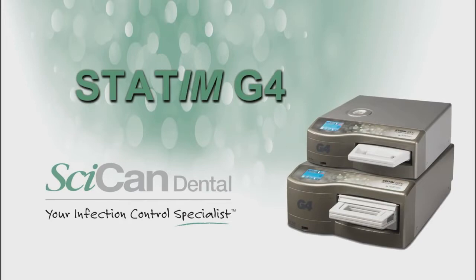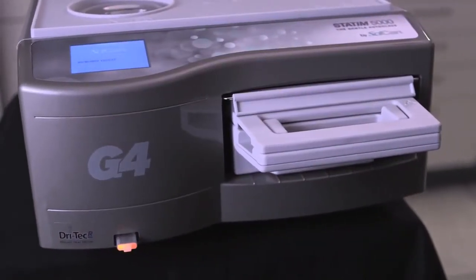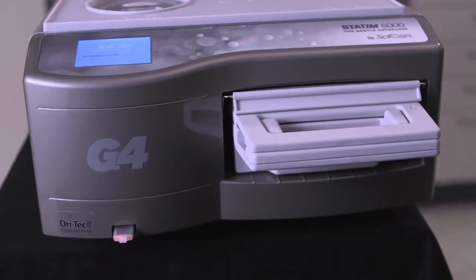Welcome to the Future of Dental Sterilization — the Statum G4, brought to you by SciCan, your infection control specialist. The Statum G4 series, the next generation of our signature Statum sterilizer, has been dramatically upgraded with cutting edge technology, providing a level of connectivity never before seen in the dental market.